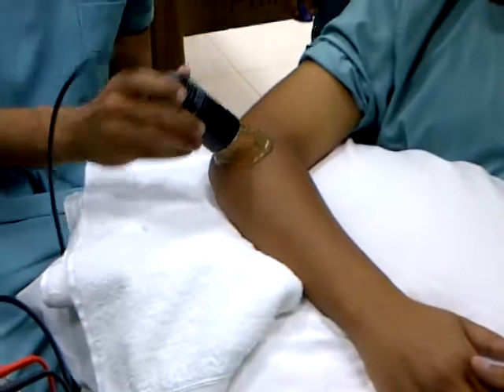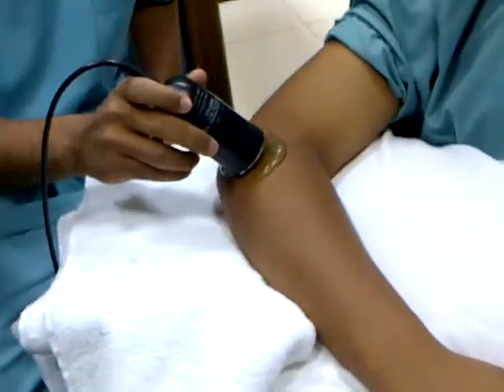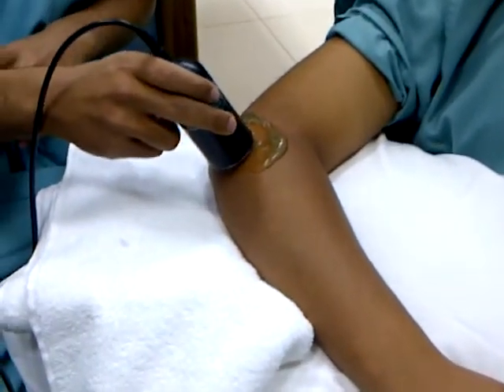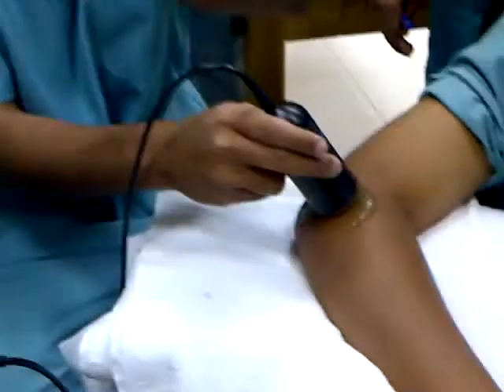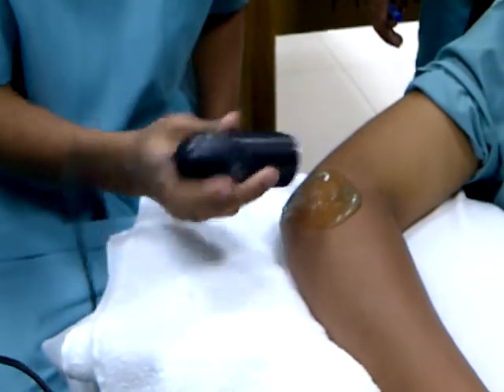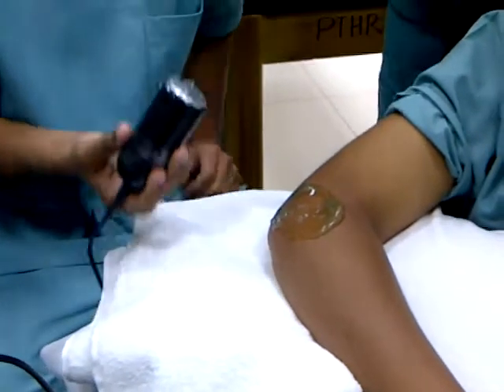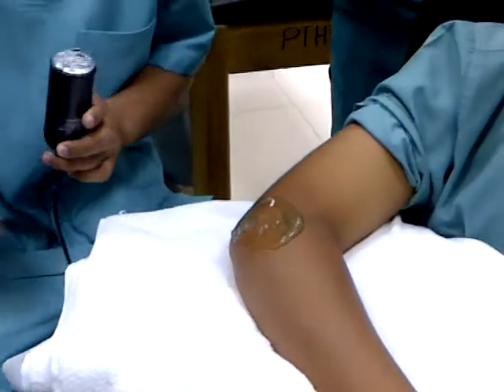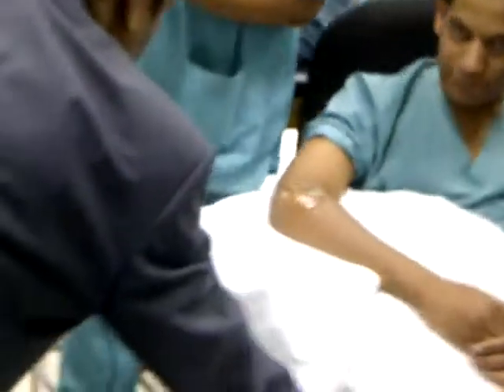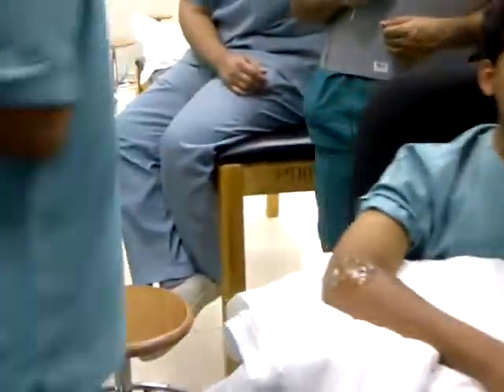Right. So once you start, listen. Which is your dominant hand? This. So how are you going to manipulate the system? Fine. So again you are crossing. You have to think, it's all common sense. So make sure, come this side. Take the chair. Let the patient position like this. Use your brain.